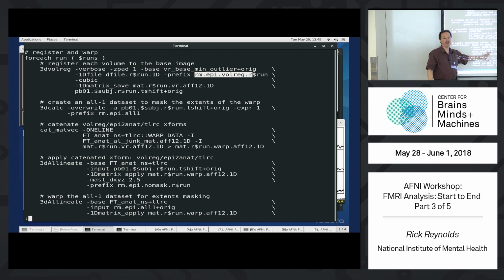Why is the long dimension ignored? Well, if you have 2 by 2 by 6 millimeter voxels, so nice squares, but then long in the z direction, what happens when you rotate that? If you rotate it, now you're mixing the z directions, the low resolution direction is getting mixed with the high resolution directions. So just so you don't lose any data, you just resample it using the lowest dimension size. Of course, it's better not to get long voxels, but that's what it does.